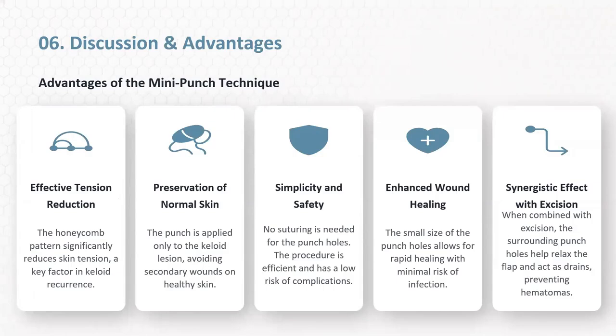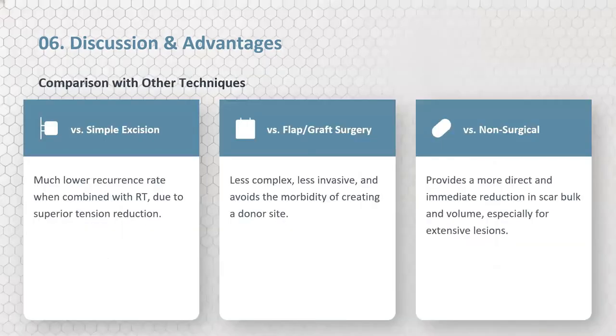So, what makes this technique so advantageous? It effectively reduces tension, which is crucial for preventing recurrence. It preserves normal skin, is simple and safe to perform, and promotes faster healing. When used with excision, it even helps the wound heal better by acting as a drain.